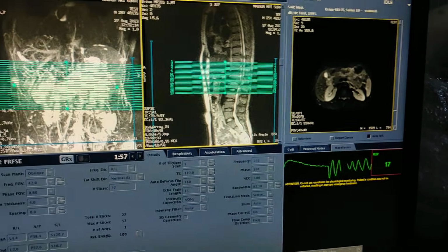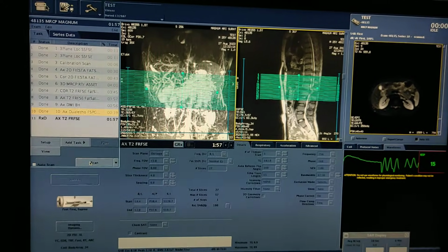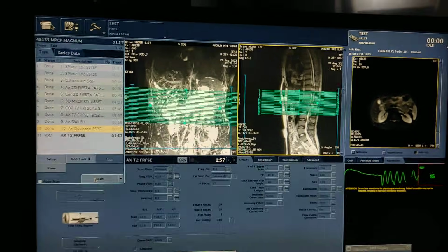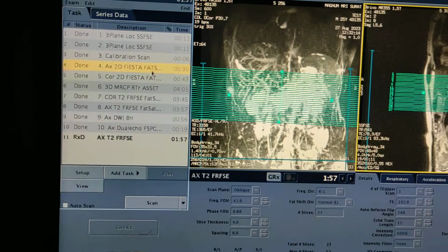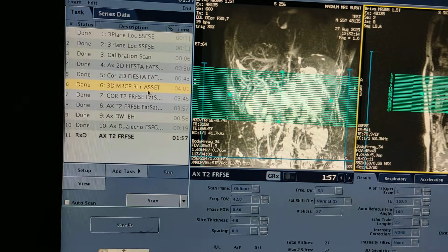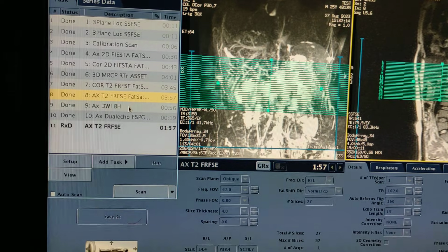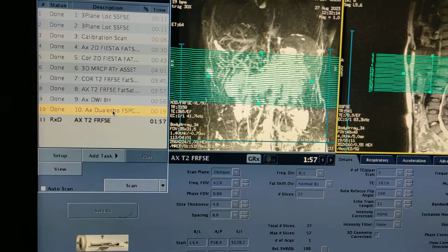Okay. So this is how you have to do MRCP on Brivo MR355 1.5 Tesla GE. Note down the protocol over here. Axial Fiesta for localizing, planning, then 3D sequence, coronal T2FS, axial T2FS, axial T2, axial DWI and axial dual echo.